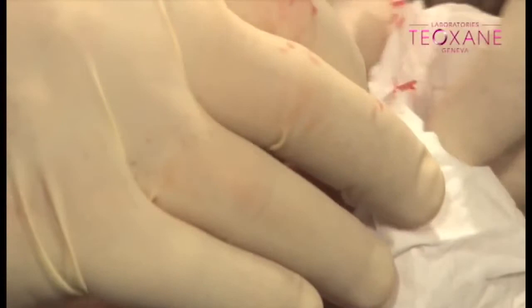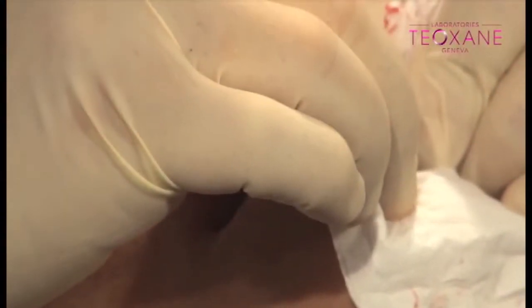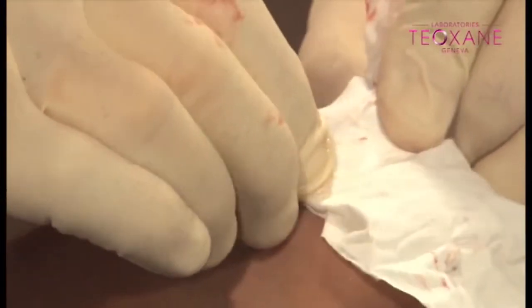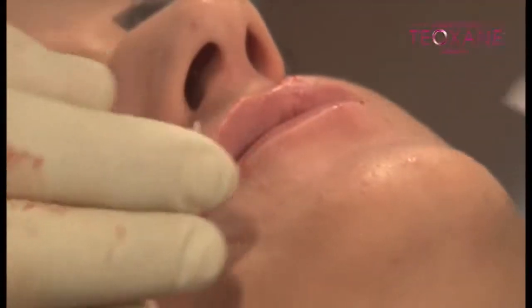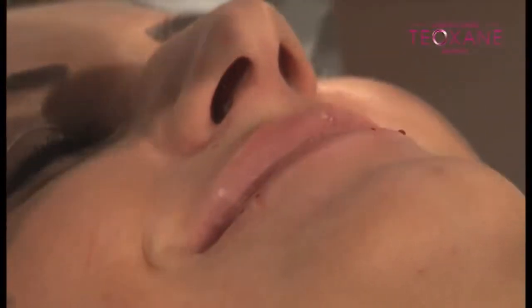I need to sculpt. Close your mouth, smile — I need a bit more. Give me the syringe to finish the work.